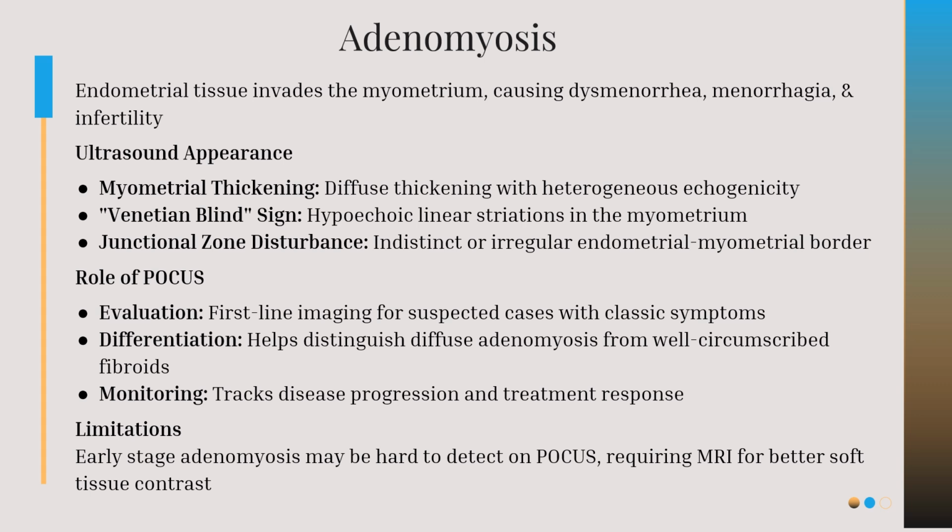The whole point, we talked about it over and over again with every single one of these ultrasounds, is you want to differentiate between something else more serious, significant, track progress with a disease, a condition, how the treatments are going, be a first line image if you have a suspected concern, to have a discussion with a patient on the next steps.